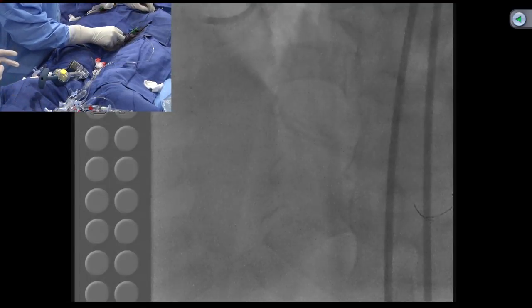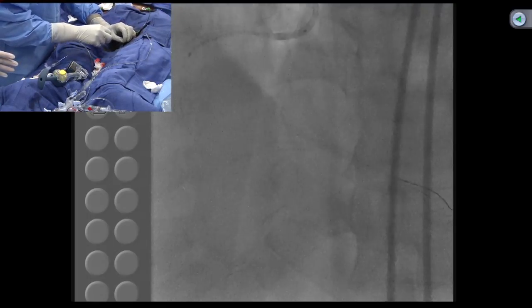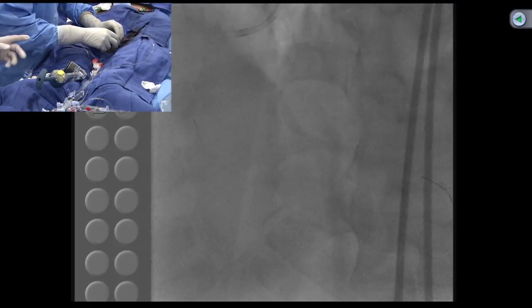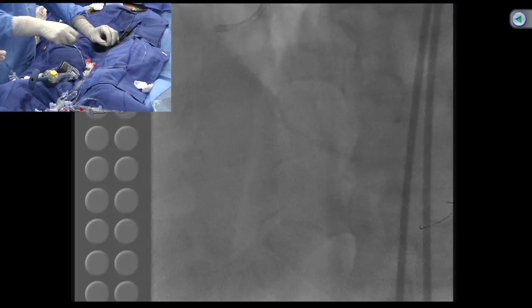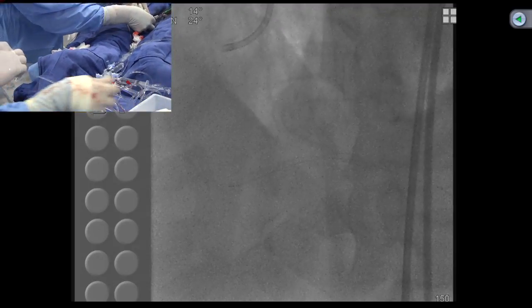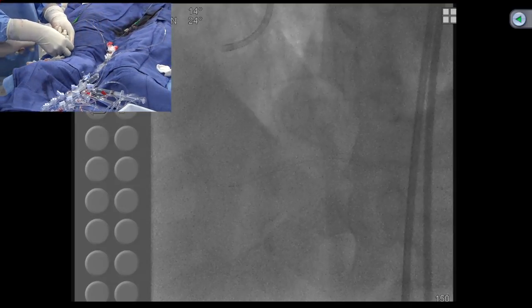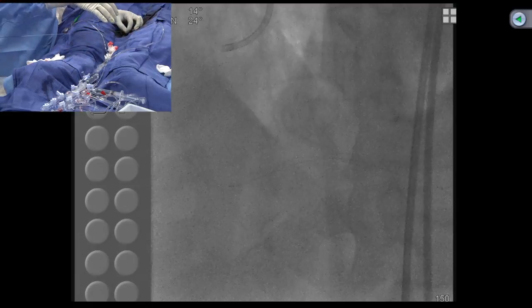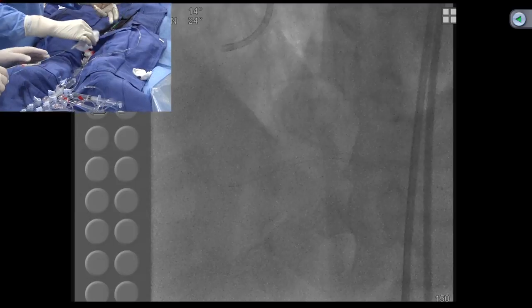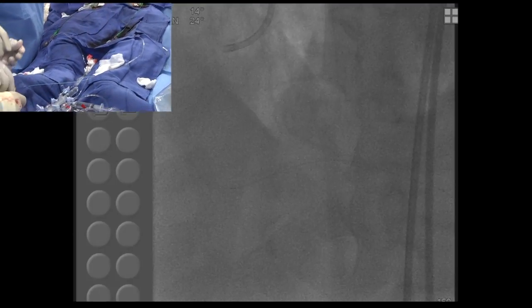Give us the run through. Yeah, give us the run through. Sir, take a deep breath. Two essential points, both philosophical as well as strategic, you have: you try to not get into any re-entry, and you cut to the chase and get the Corsair in quickly. That's it. And then you mentioned that once you have achieved this, go ahead, rely on the antegrade wire and dilate through that. Yep, absolutely.